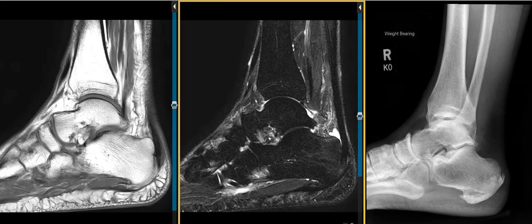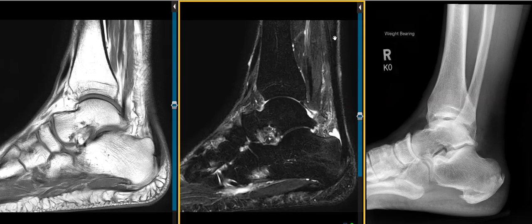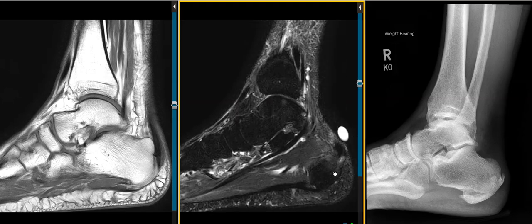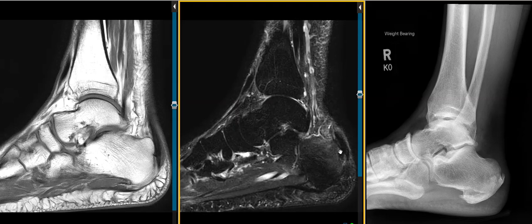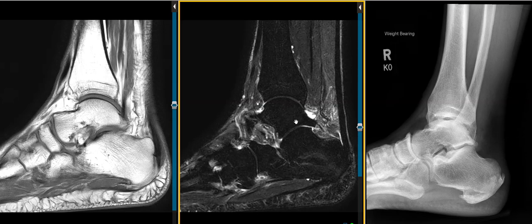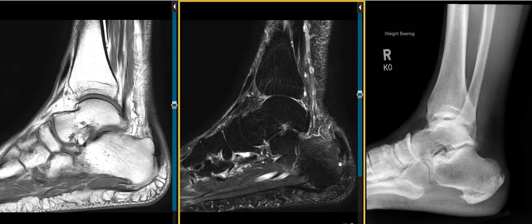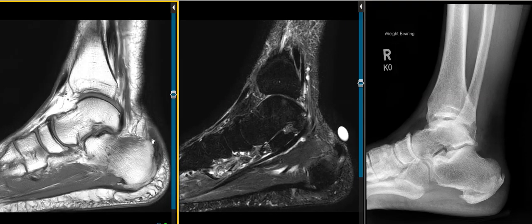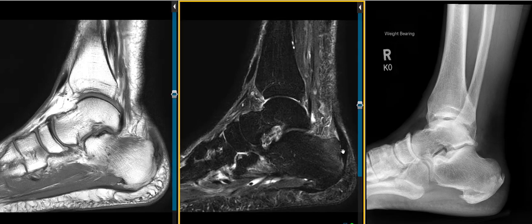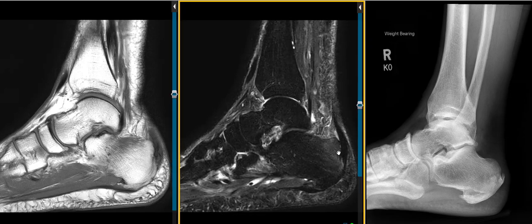On this view, we have a fluid sensitive sequence where fluid will show up as bright. So we see the dark Achilles tendon as we go off to the side where the marker is. We see some foggy brightness here in the bone. Normally bone will be very low in signal in this sequence, and we see this bright area here. We call this marrow edema. So the Achilles tendon is inflamed, which we can see over here, that gray signal. We have reactive marrow edema from inflammation irritating the bone back here.